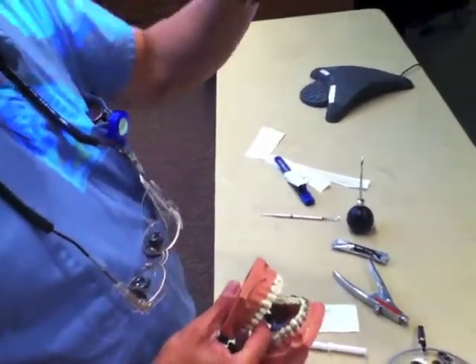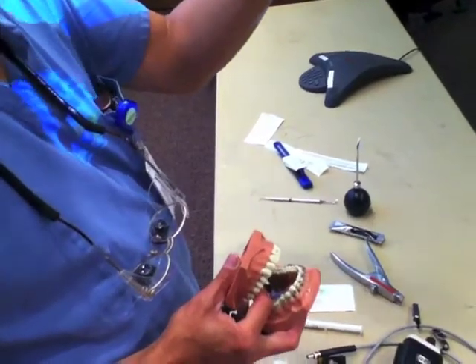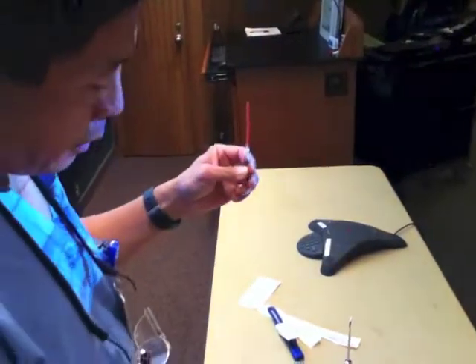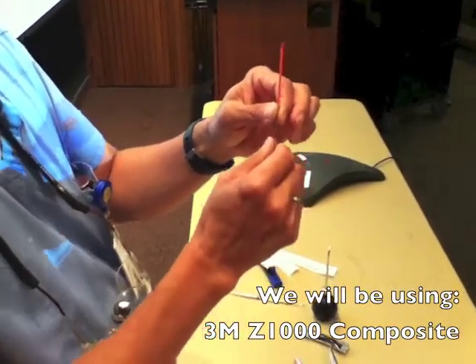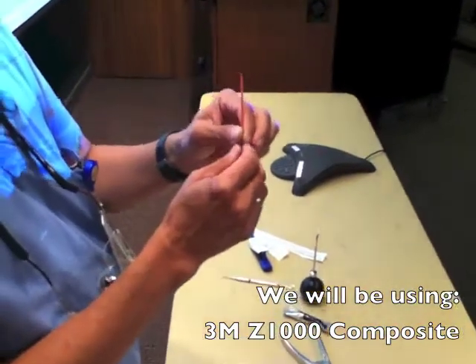There's a system of wells — this material has a little bubble pack with a little well on it. The second system we're going to be using is a two-well system. You squeeze one, it goes into the second one, you fold that over, and squeeze that into a third well.